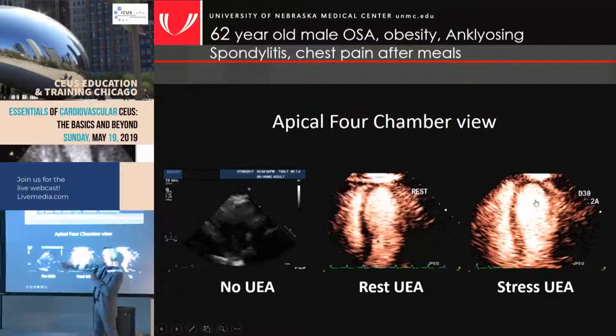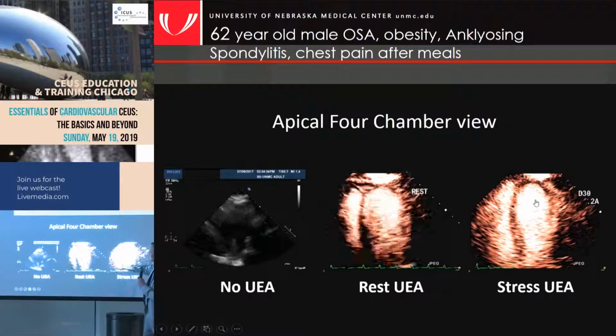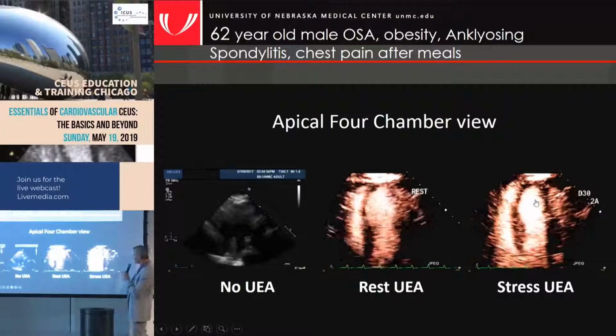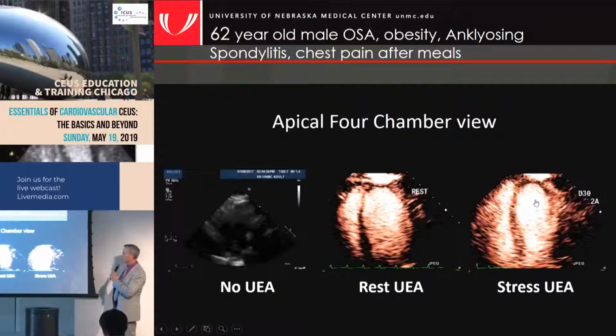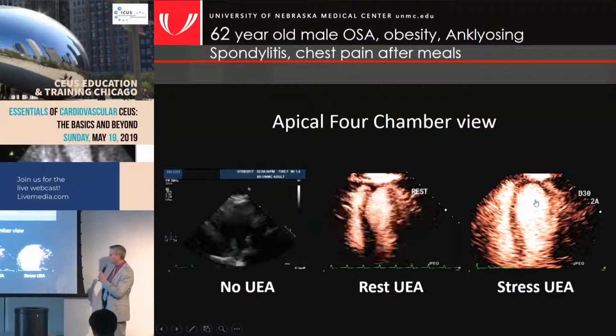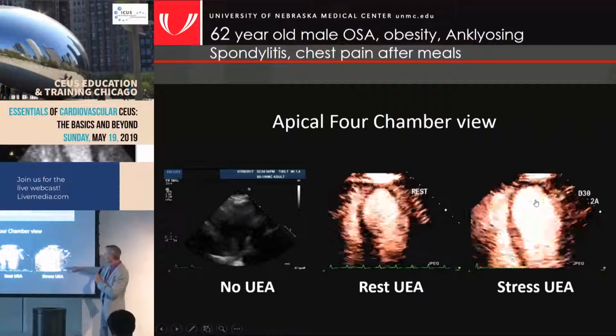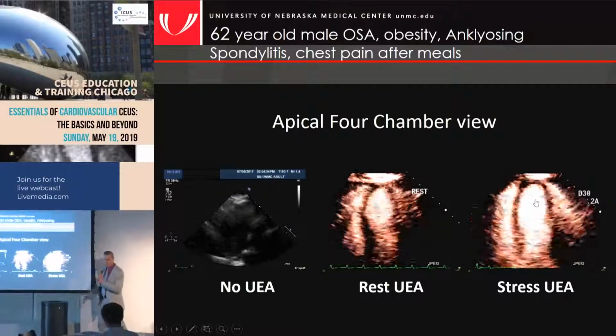Down there on the contrast images? On the contrast images, no, we keep it down here. That's not a focus. My question here is, typically I know we recommend keeping that focus low, and from here it looked like it was mid cavity. So I just want to clarify. No, I'm 100% sure that's not the focus, because we have everybody keep it at mitral valve level or lower. Thank you for bringing that up.